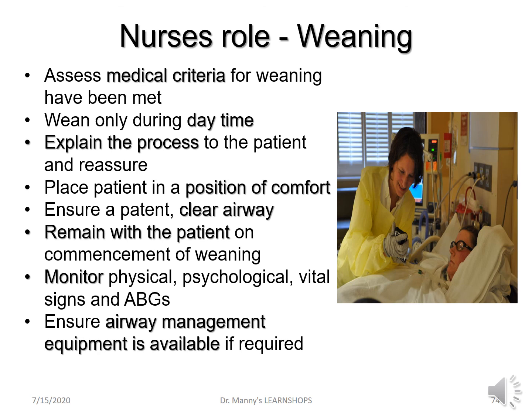Place the patient in a position of comfort, which is typically going to be at about 30 to 45 degrees, if they are allowed to be in that position, because they are, as we should indicate, hemodynamically stable, or they don't have any mechanical issues such as spinal issues or pelvic issues.